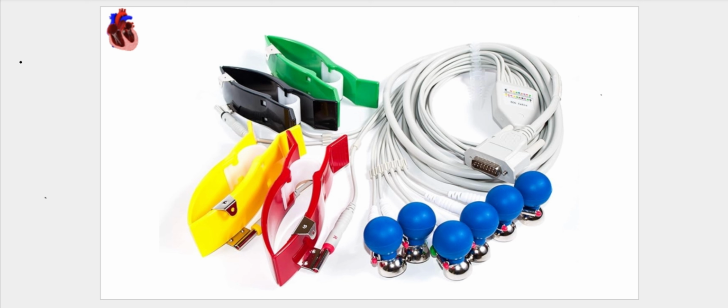Maybe what we should be aware of when you talk of leads is that these normally consist of electrodes. Electrodes can be negative or can be positive, and this gives us the three different types of leads that we anticipate in an ECG. For example, we've said that the ECG contains 12 leads. This can be categorized into three main categories.